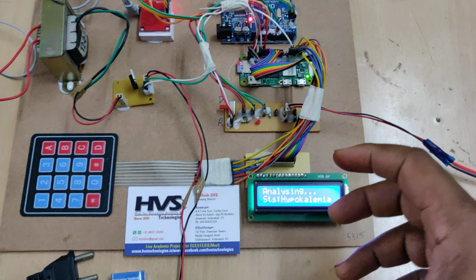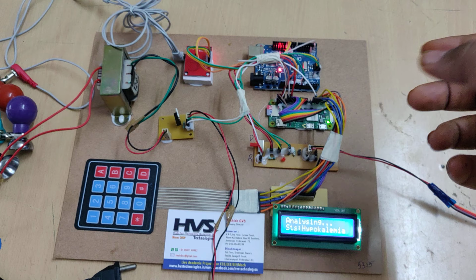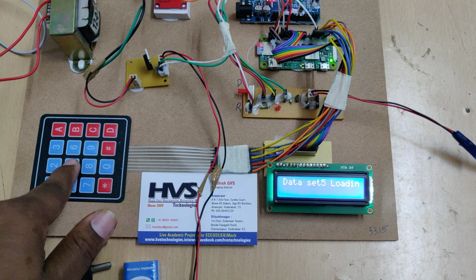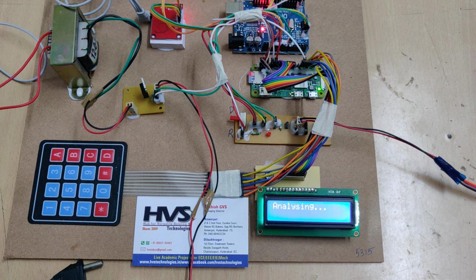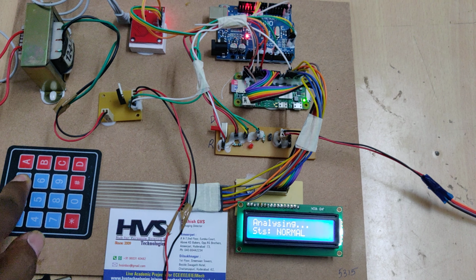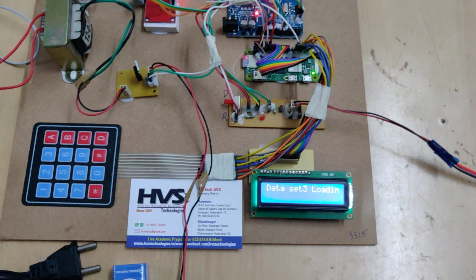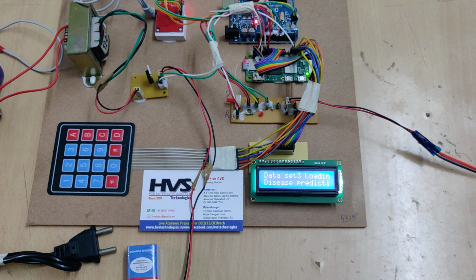Instead of providing the input from the ECG signal, we have provided the same signal data which we would provide from the Arduino UNO to the Raspberry Pi. So then we are going to provide the dataset mode. Let's consider the 5th. It's normal. If you place these electrodes on your hand, then whenever the disease is detected, automatically we will get the stimulations from these 2 electrodes.